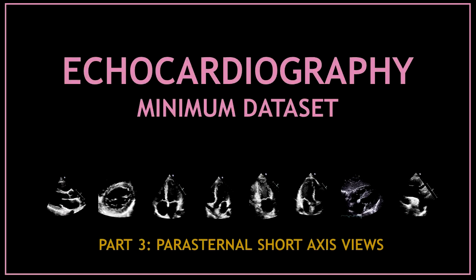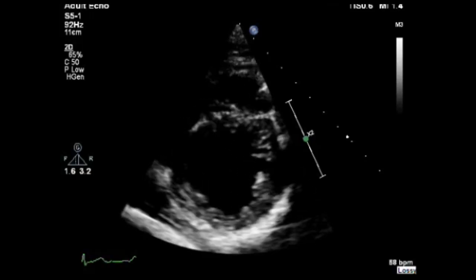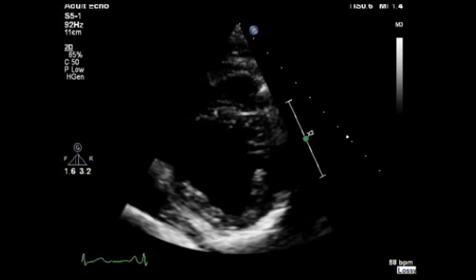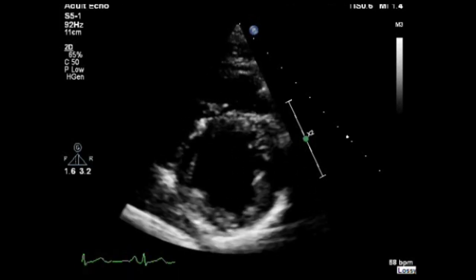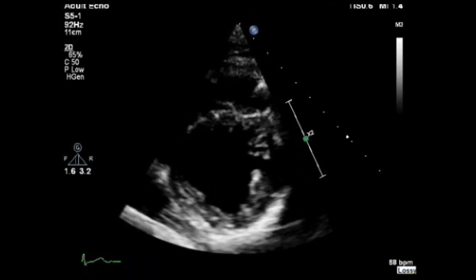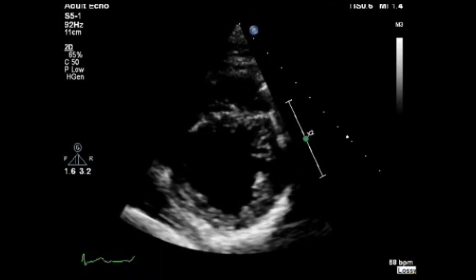Now I'm going to show you on video, one by one, all the measurements you need to obtain from the parasternal short axis views as part of the minimum dataset. Let's start with the short axis view at the apical level and assess for any regional wall motion abnormalities of the apical segments.